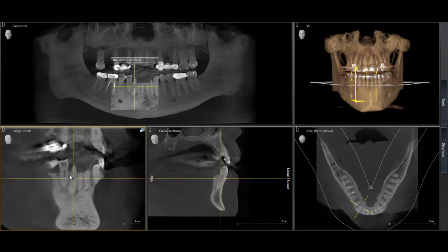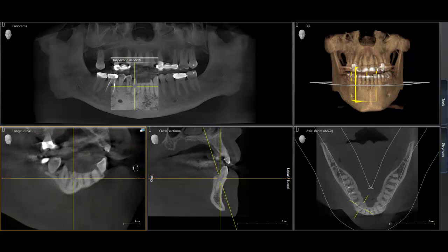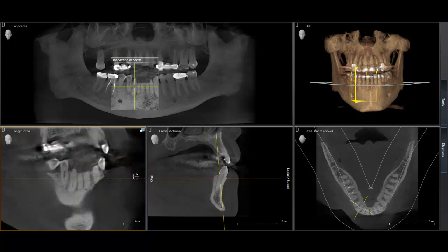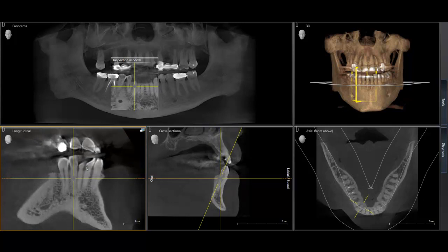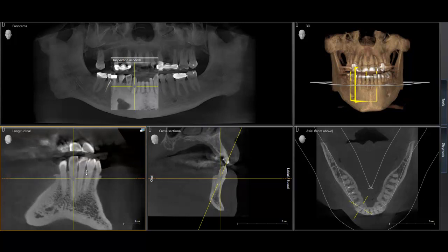So what do I do? I'm going to grab this little orange dotted line here, and when I left click and hold, you'll see the angulation of this line change. I'll get it aligned with the long axis of the tooth, and now when I let go, you can see we've got what appears to be a nice PA here of tooth number 27.